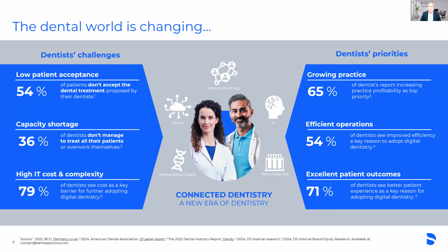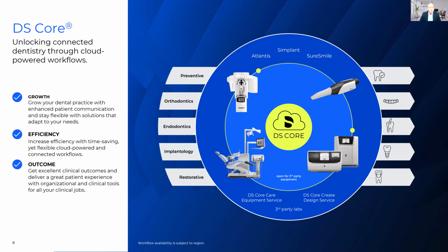And then, how does adding digital technology really enhance the efficiency on the clinician side? So that on the priority side, if you're trying to grow your practice through adding technology, we have to make sure that it's connected through this new connected dentistry. And that's the era that we're moving into, making you more efficient in your offices with your patients, so that way you have more time. So DS Core is our software system that connects all these different digital technologies. So giving you the ability to grow your dental practice through enhanced patient communication. We have patient canvas.